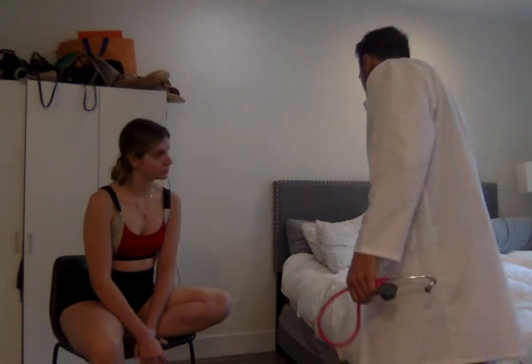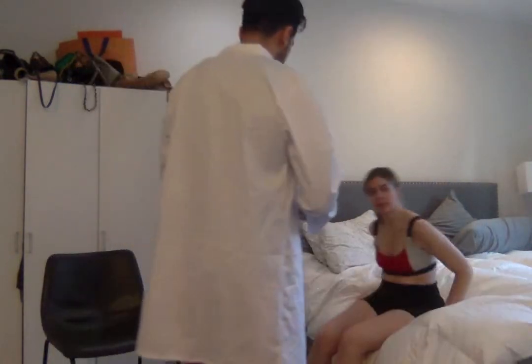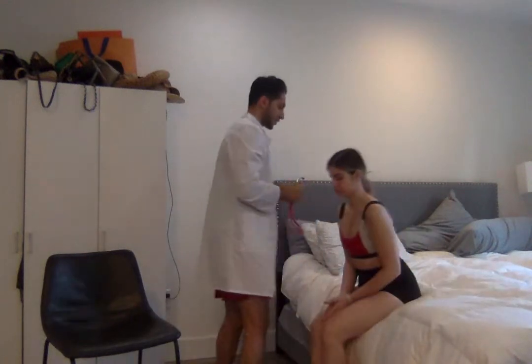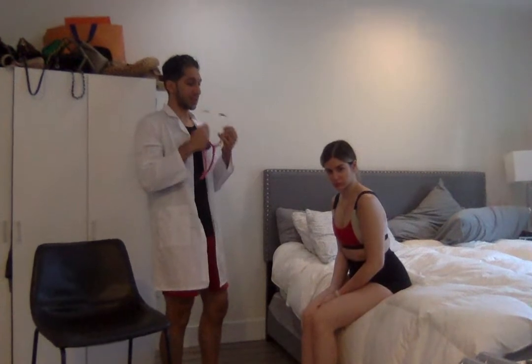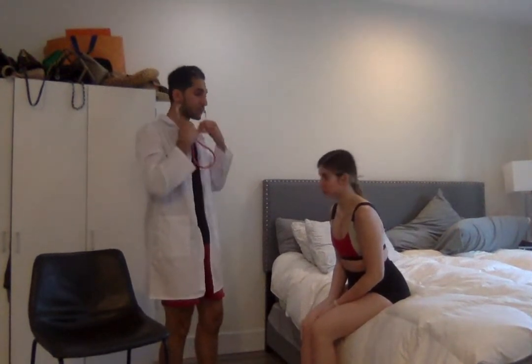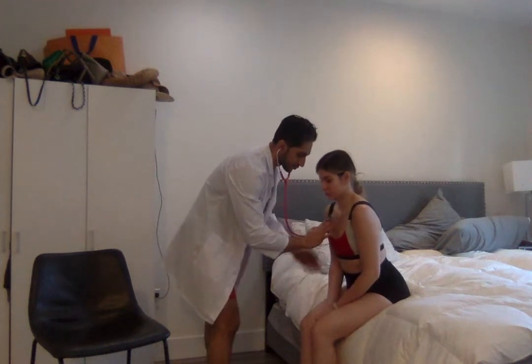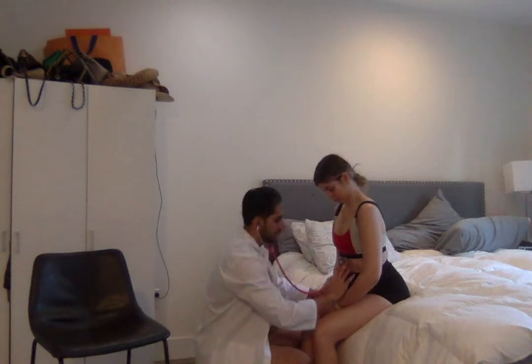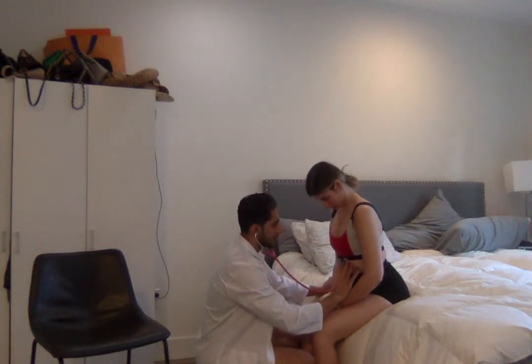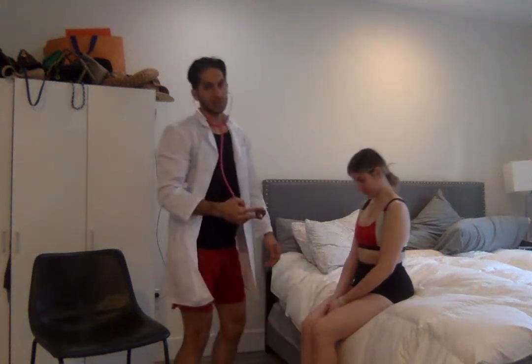Let's sit over here. You're going to lean forward a little bit, and I'm going to do the same thing. I'm going to listen for heart sounds when the patient is leaning over. Aortic, pulmonic, tricuspid, and mitral. All S1, S2 sounds heard.